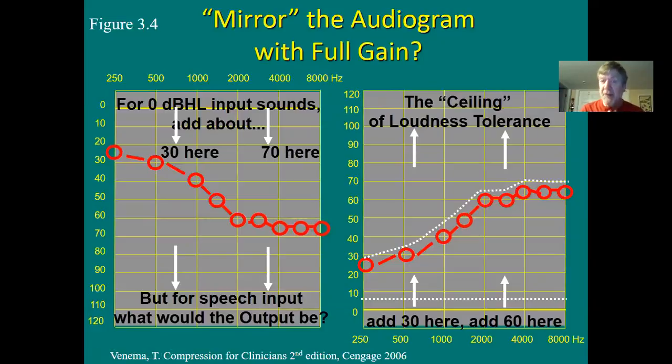You see? Look at the right. This is what new real ear is doing today. We're taking the audiogram, the odd audiogram, we're taking that weird audiogram and we're flipping it right side up. And now you can see the hearing loss plotted up instead of down. Because now the hearing loss and hearing aids are speaking the same language. They're plotting the decibels up. God knows why we started plotting the decibels down on an audiogram. There's an interesting article by James Jerger on that, but I digress.